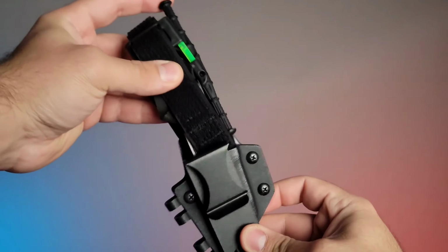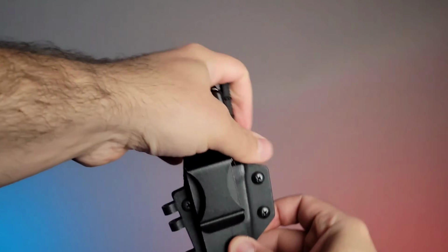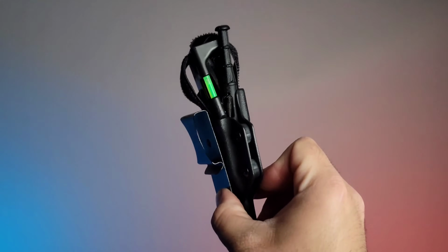Now, I know a lot of people might do that separately. If you train enough, I'm sure it'll be fine. You'll work it out. However, I would still say just be aware that if it's in your primary reload location, you don't want to end up with a tourniquet after not training that much, because you don't want to accidentally draw a tourniquet instead of your spare magazine. So simply be aware of that. In regards to size, it absolutely does fit in a spare magazine carrier, and it works really nicely.